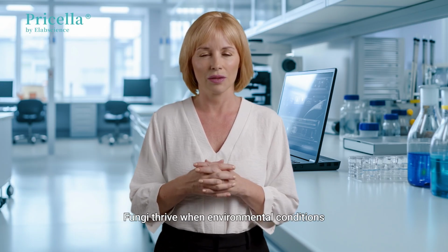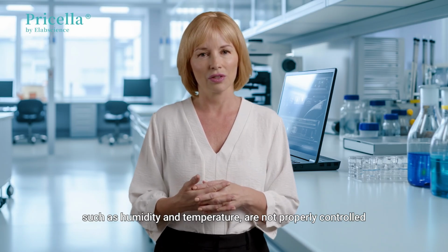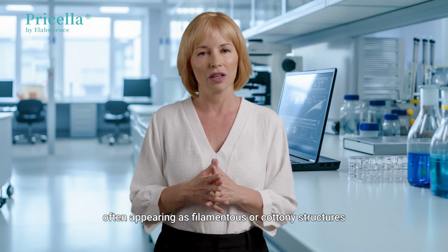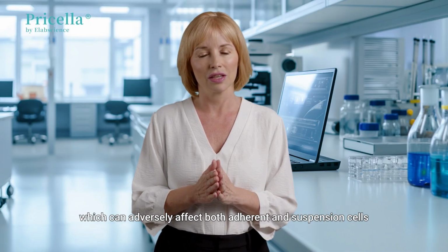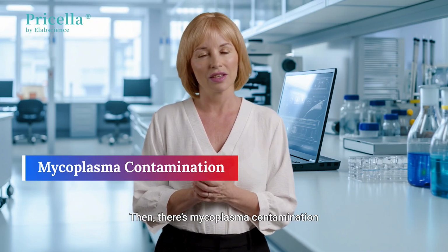Next, fungal contamination, including yeasts and molds, can also wreak havoc in cell cultures. Fungi thrive when environmental conditions such as humidity and temperature are not properly controlled. This can result in macroscopically visible fungal colonies, often appearing as filamentous or cottony structures, which can adversely affect both adherent and suspension cells.